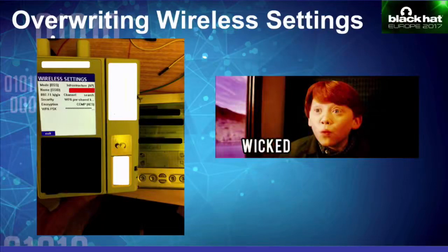So we were really excited about it. So we opened up the app, looked at the network settings, and there was nothing in there. So I think someone on the manufacturer side figured out that it's generally a bad idea to export these settings to a foreign device, so they blocked it. So that's really good of them. All we received was a blank template. There was no data in there that could be used. So we were a bit disheartened, but we did what you do to a template. We filled it.